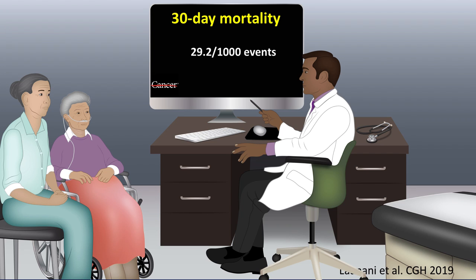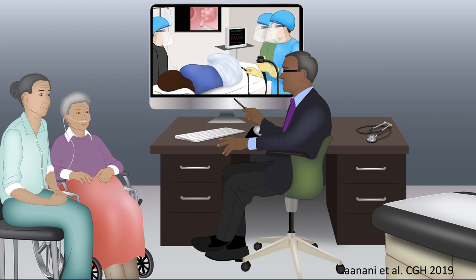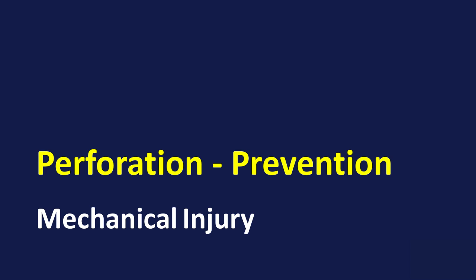So when it comes to an older patient who has a polyp, it is important to find a senior endoscopist with a lot of experience on his belt to perform those procedures so that these patients can come out without a significant adverse event. Let us talk about the different mechanisms of perforation and how to prevent them.